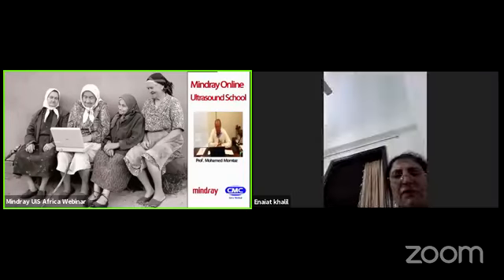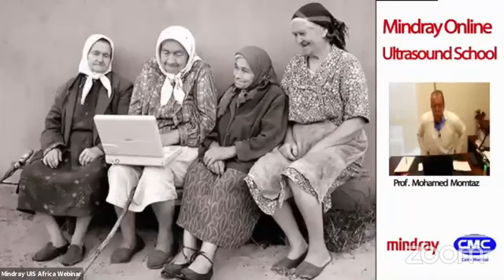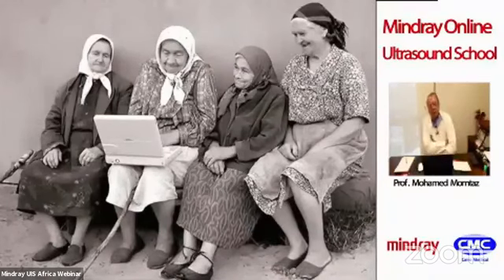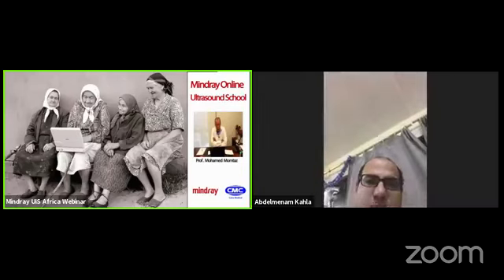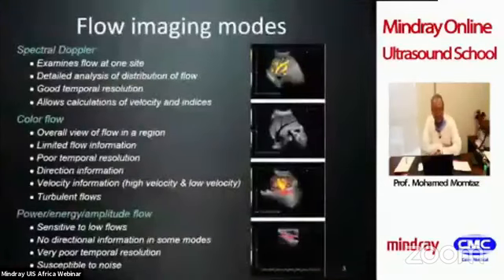As you can see here, it's never too late to learn. I have presented Doppler ultrasound many times, and in some instances I find that doctors, especially those who have been practicing obstetrics for a long time or using 2D ultrasound only, when you start to teach them Doppler, think that it is very difficult or impossible to learn, and that it is too late for them to start. Actually, it's never too late to learn, and Doppler is very easy.